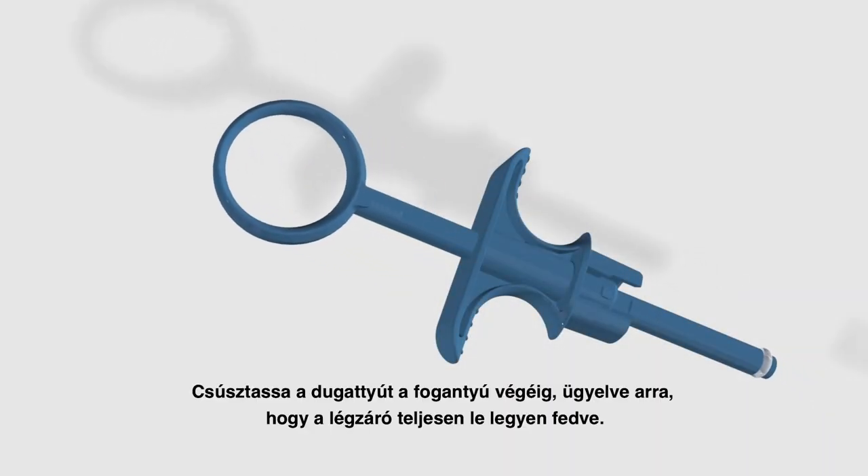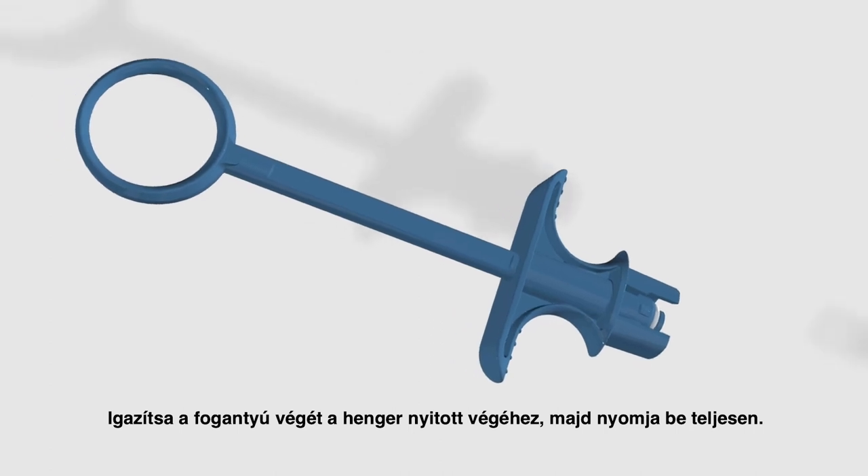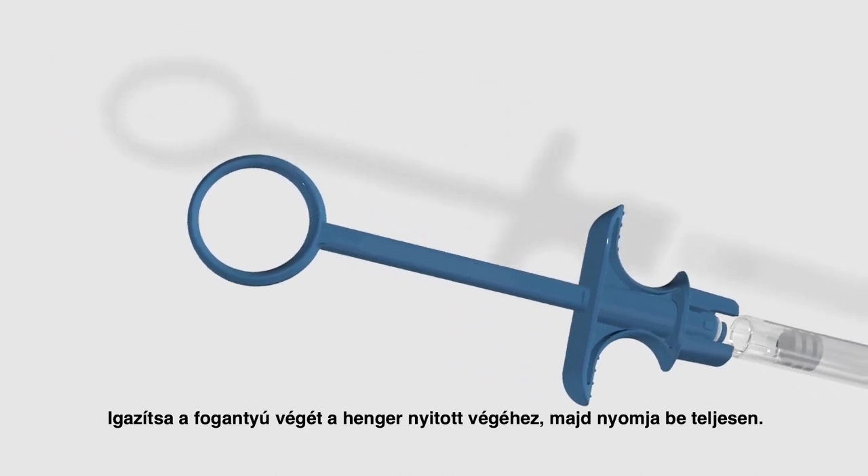Step 2: slide the plunger to the end of the finger grip, making sure the o-ring is fully covered. Align the pins on the handle with the notch of the barrel and then push until the end.